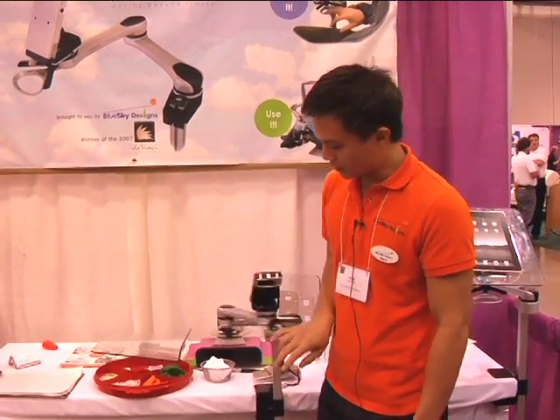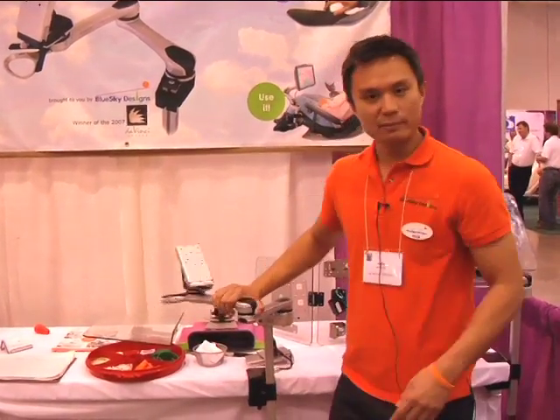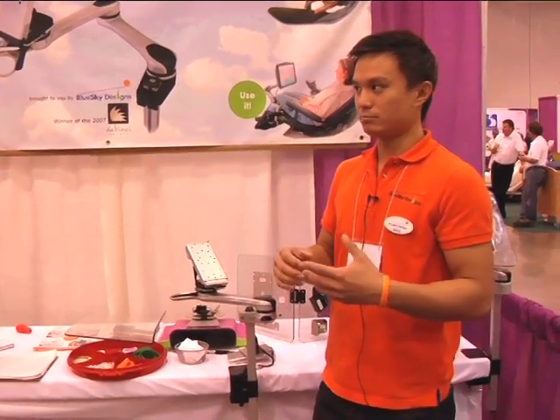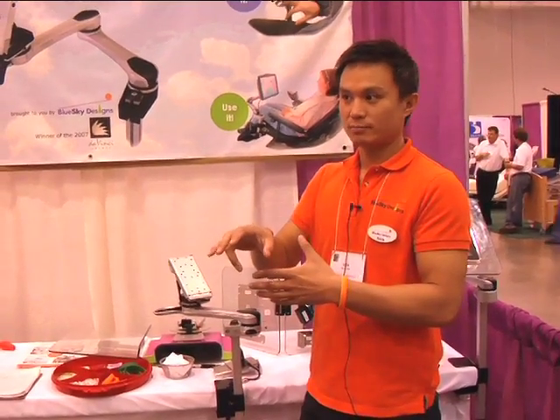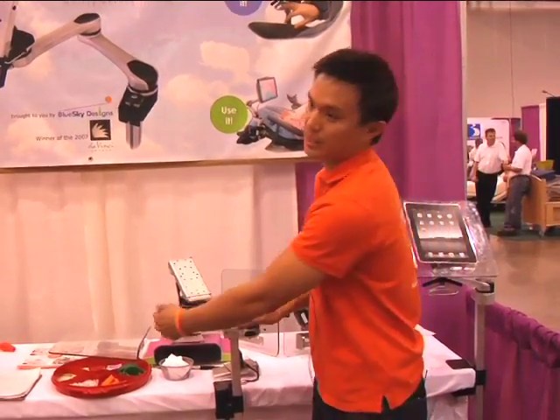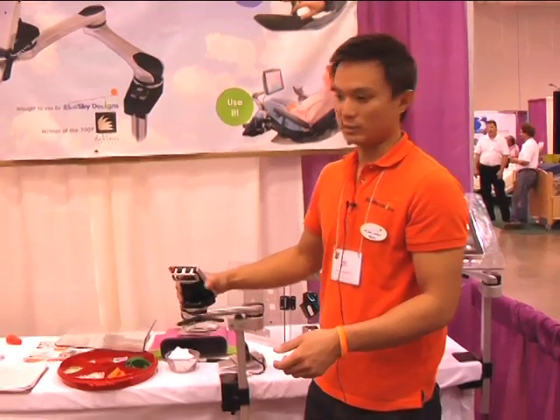All these joints can be manipulated and set to remember where they're going to lock. Some folks actually have it set so it doesn't lock anywhere and it's just an articulating arm, and some folks have it lock at every single spot so they have the most flexibility in where it locks.